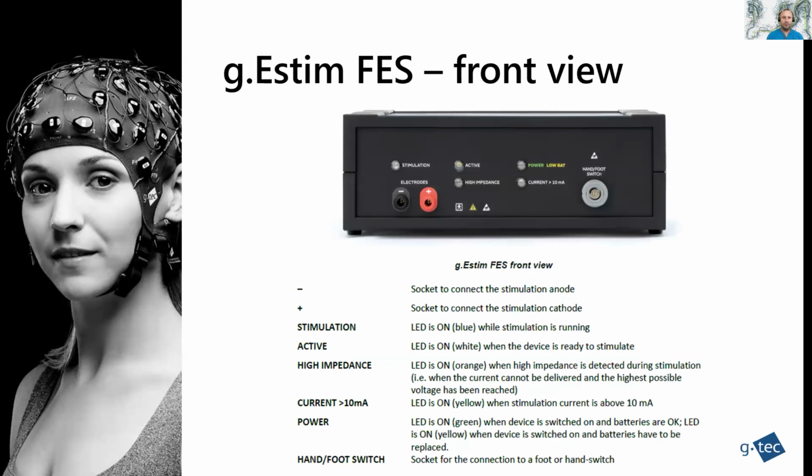I want to switch now to the practical part in principle already. I have some more slides, but I will show them a little bit later during the experiment, because today what I want to show you is a motor imagery experiment where we will control the stimulator by imagination of a movement, left and right side, and therefore I will prepare now my colleague, and then we will do a training session with him.